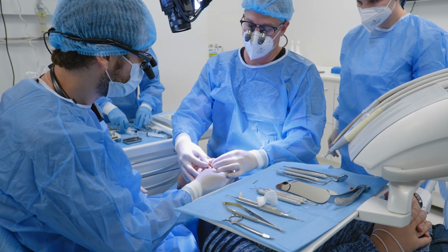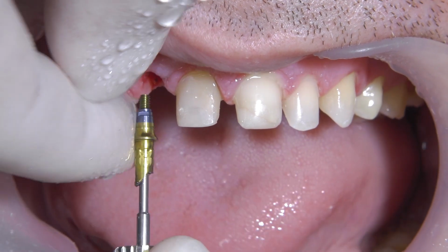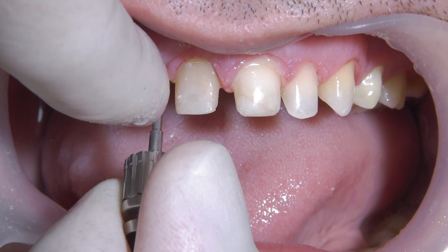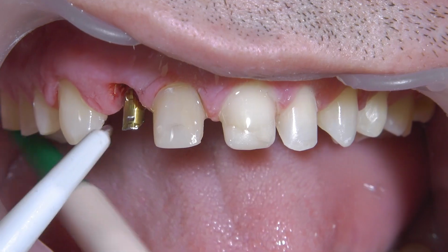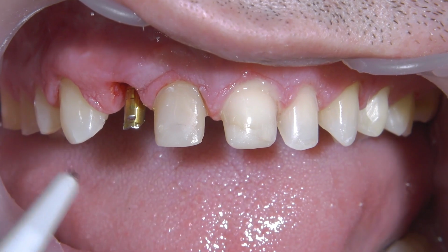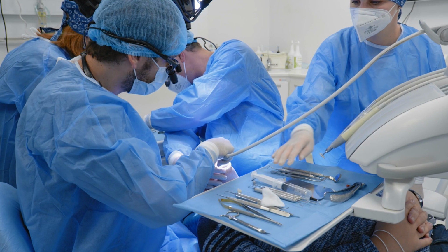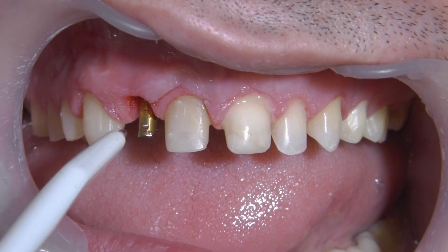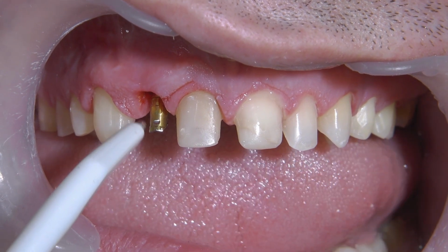Okay, let's go back with the cylinder. Just cut a little bit, and we go back. Great. The components are anodized in yellow color, but in order to have a very nice result, we always like to use an opaque composite here in the buccal area, okay?